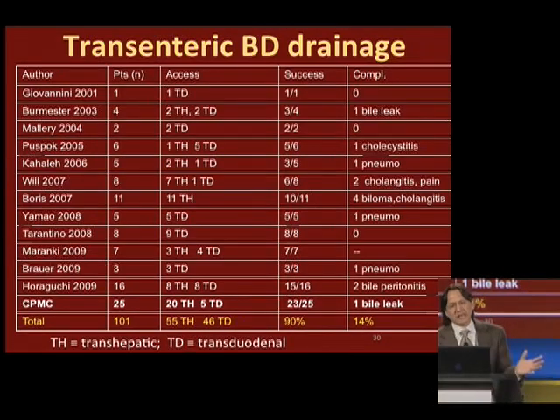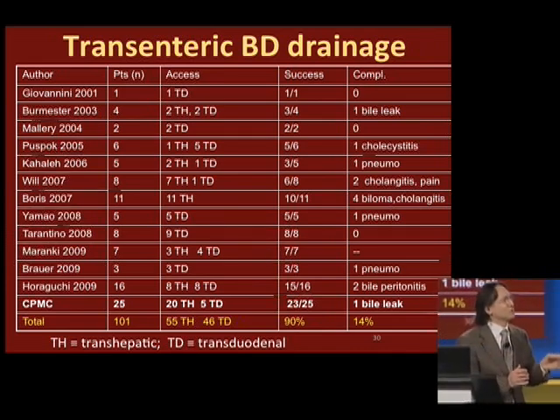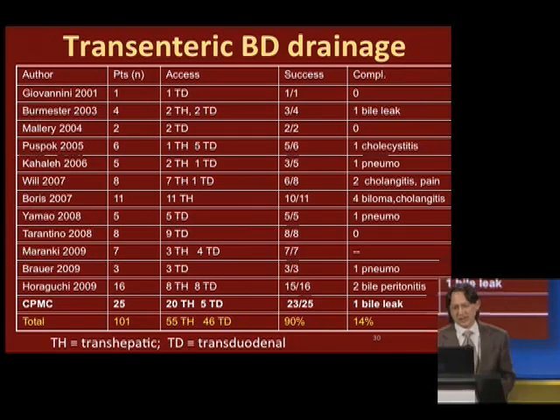Now this is a compilation of some of the results that have been reported. It's still a very young field. As you can see, there have been maybe slightly over 100 cases that have been reported. The success rates have been remarkably good, in the order of 90%. Now there have been complications, of course. This is an evolving technology. And I'm going to highlight this in just a moment, but this is where we need better tools, because we need to reduce that complication rate.